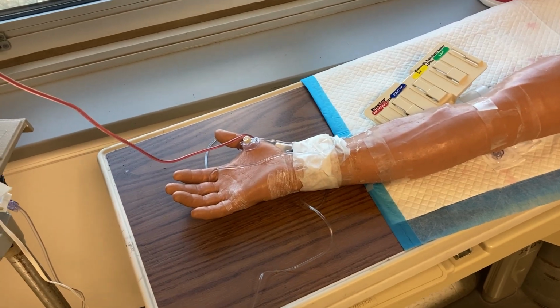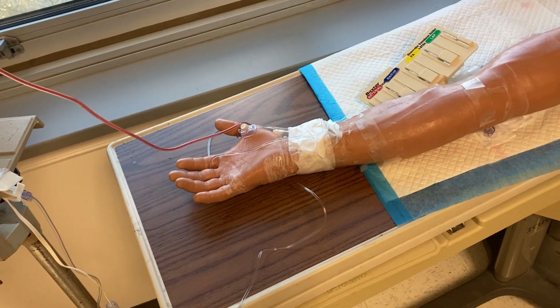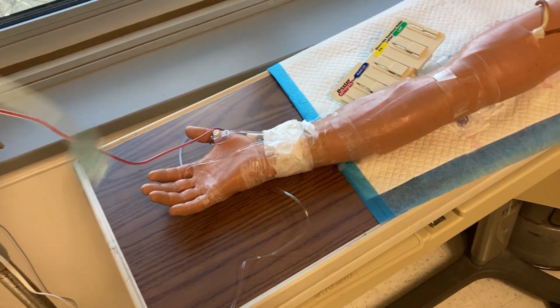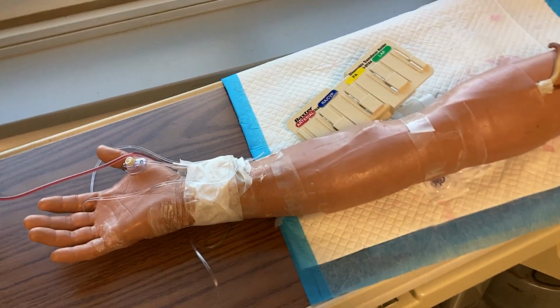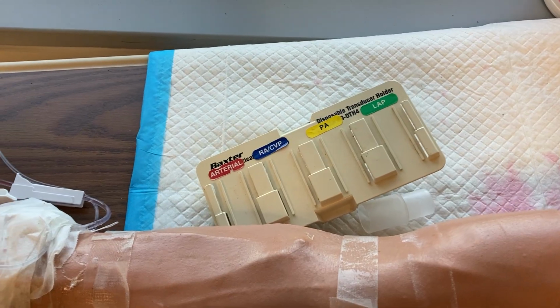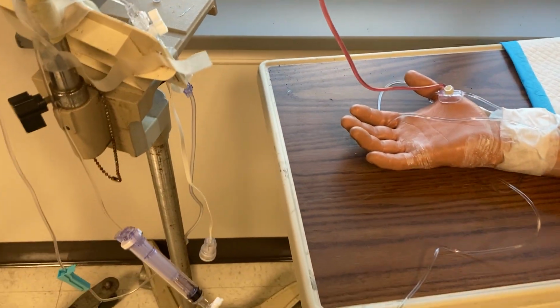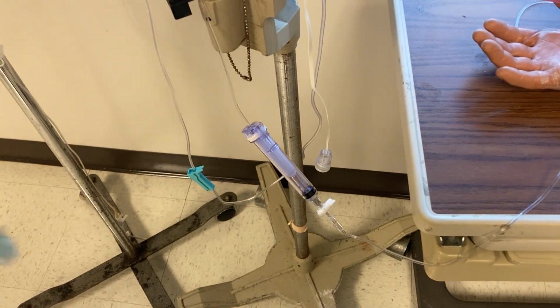As a respiratory therapist, you may be tasked with withdrawing an arterial blood gas sample from an indwelling arterial catheter, such as a radial artery catheter that's been placed here. With the arterial line, there may be several lines in the patient, so you need to make sure that you're paying attention to which one you should be drawing off of, whether or not you're utilizing an open system or a closed system like you see here.